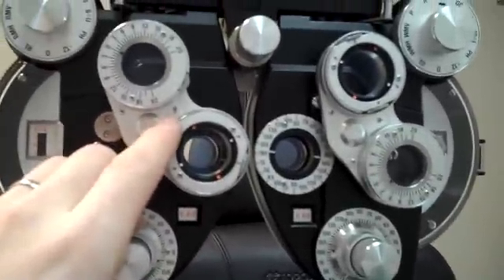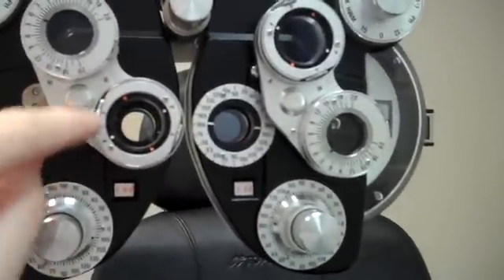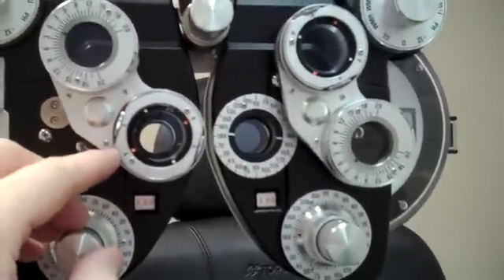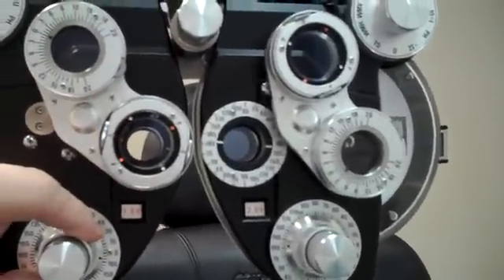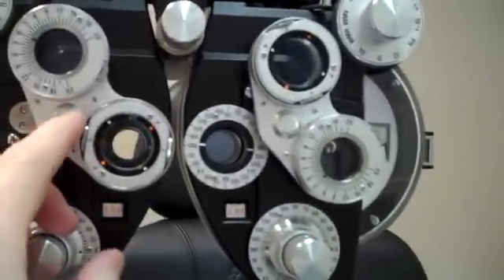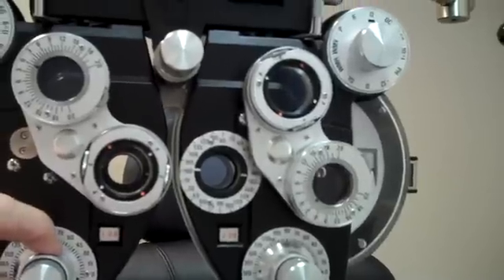You're going to hear it in all kinds of different ways, but in essence these are the choices — that's one, that's the other. Depending on which one looks better to you, let's say number one did. See the little red dot there? I want to move that angle towards the red dot, maybe 10 degrees, maybe 5 degrees. Then we'll do it again — number one and number two. Maybe one was better, so we'll go somewhere in between.